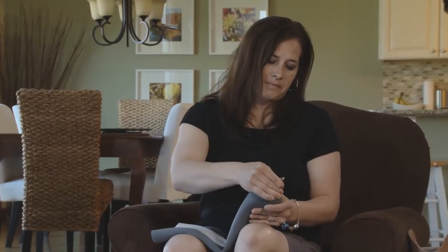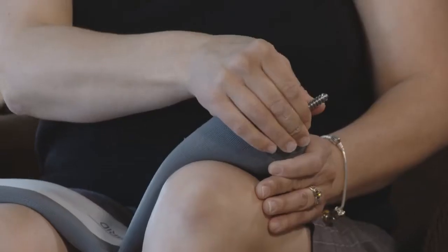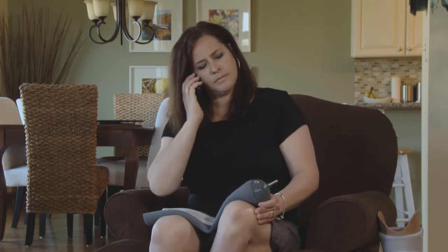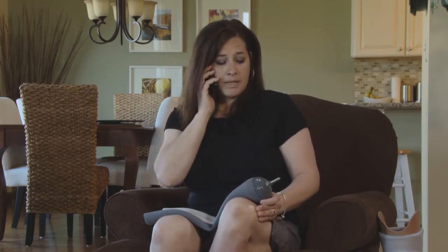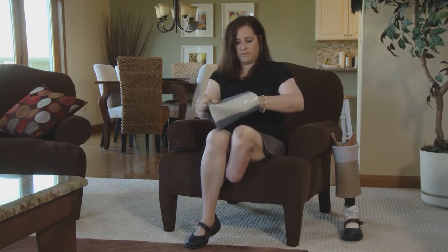If you are using a locking liner, check to ensure that the locking pin is secure. Each of your locking liners should have its own pin, securely fastened to the liner by your prosthetist. If you notice a loose pin, contact your prosthetist immediately. A pin that is not secure could come out of the liner, resulting in the potential for you to fall and injure yourself.